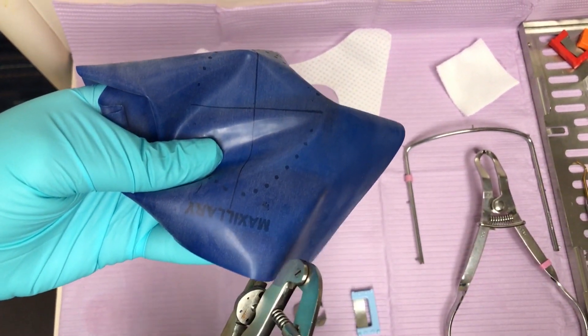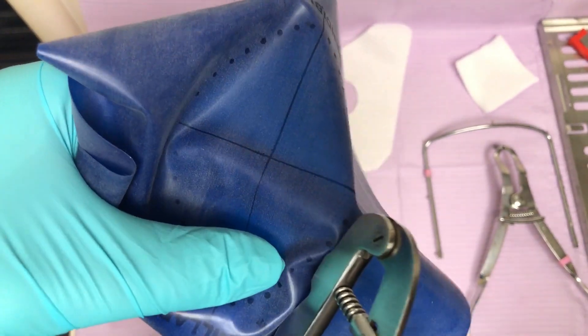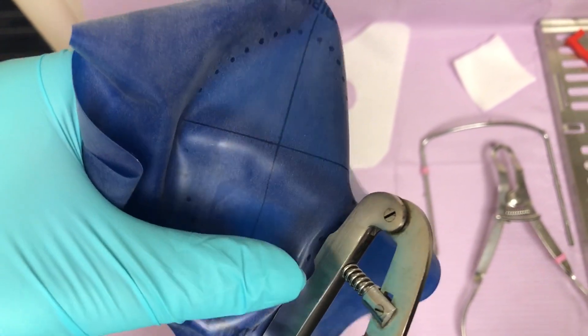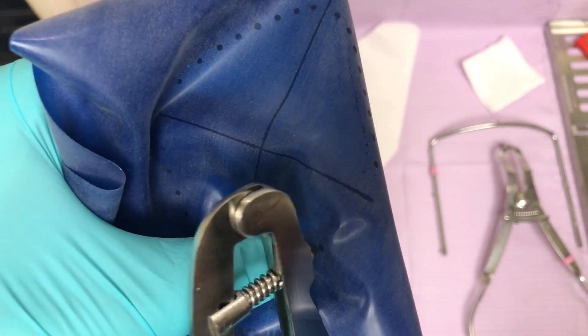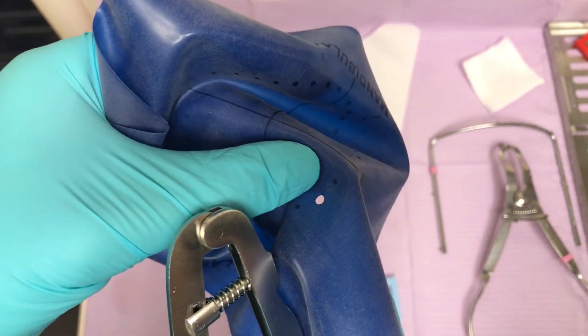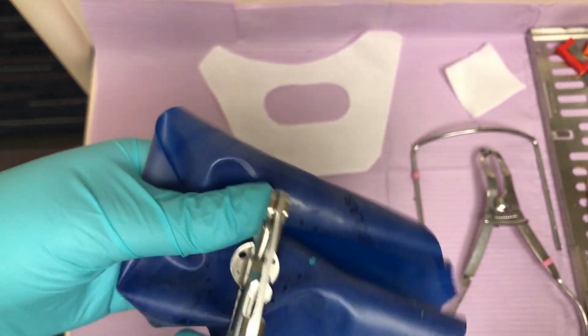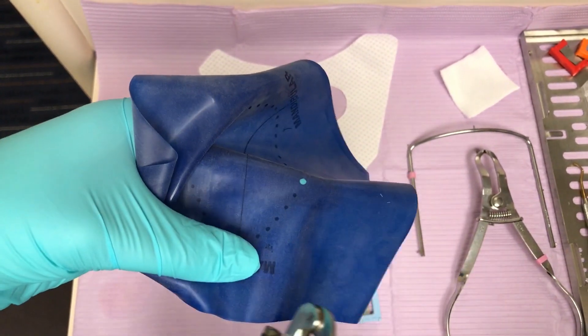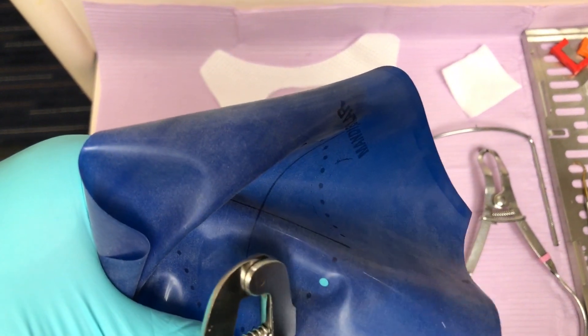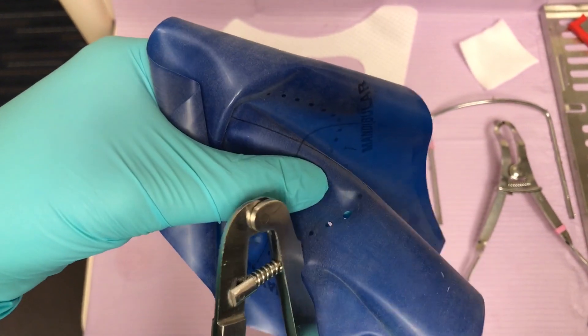Starting with the largest hole on our rubber dam punch, I punch a hole for where our clamp will be. I always use the biggest hole for the tooth I'm going to be clamping. Once that tooth has been punched, I move the hole punch down one size for number 14 (the 2-6) where we are going to be working. For the remaining teeth in the quadrant, I go down one hole size and punch the rest of the holes.